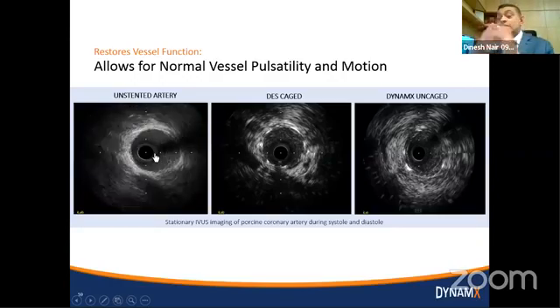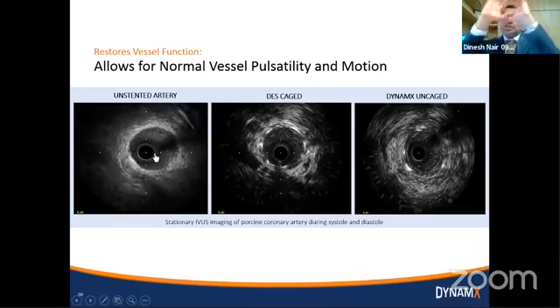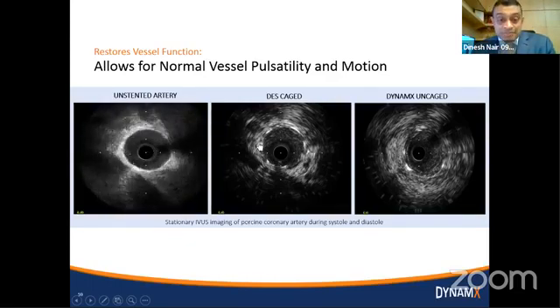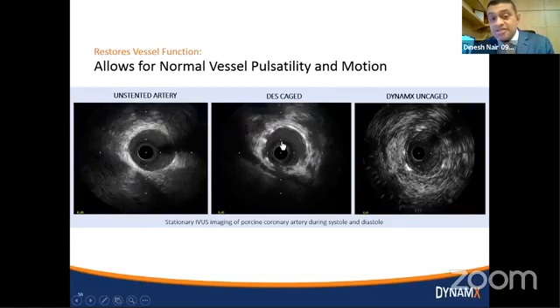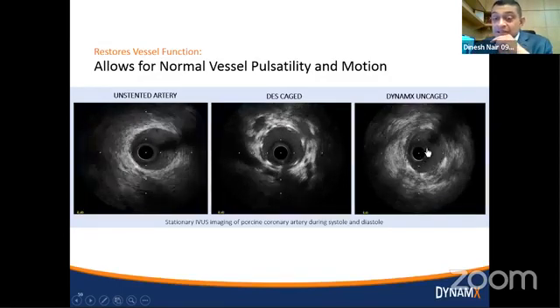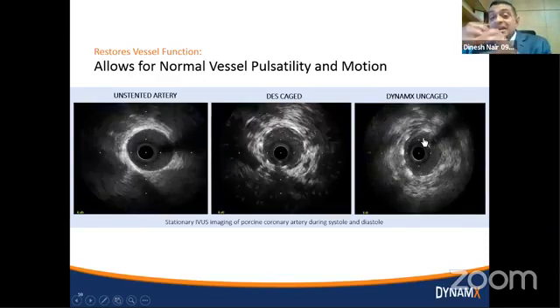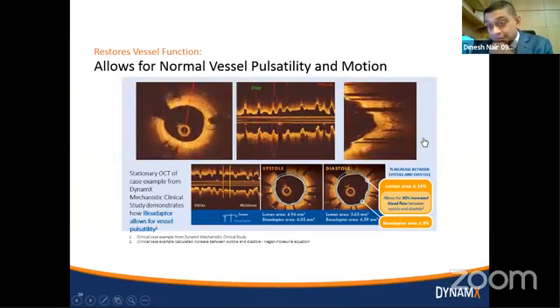So this is intravascular ultrasound. I mentioned this a few times because what you do is you pass a wire through and you do an ultrasound looking out. Many of you will have seen this, with ultrasounds of the heart, ultrasounds of the fetus. This is a vessel moving. This is what the vessel looks like when you put a stent in. It doesn't move, it doesn't pulse the same way as this guy over here. But after the uncoupling of the hinge, this fella is moving a lot more like this one over here. And by doing that, we reduce the shear forces and stresses within the artery, allowing it to function as it should, allowing it to function as nature intended it to function.